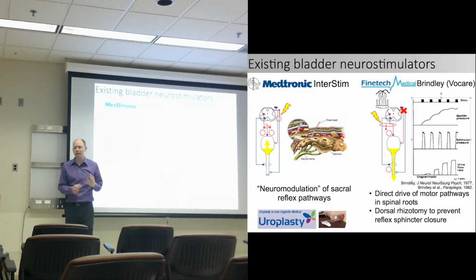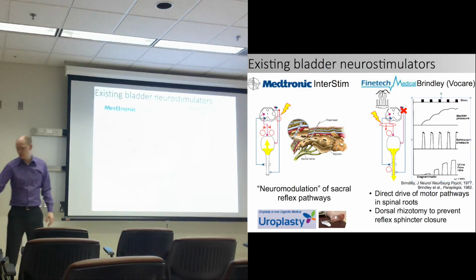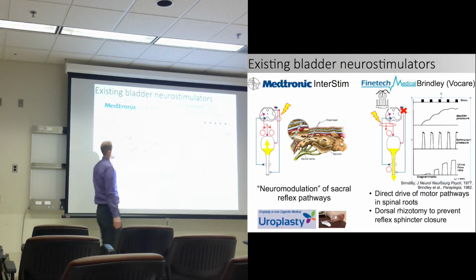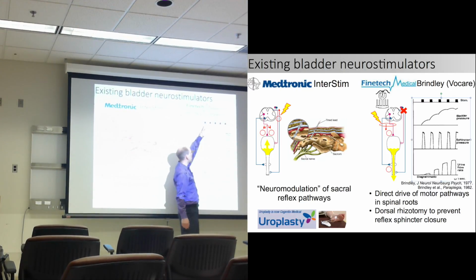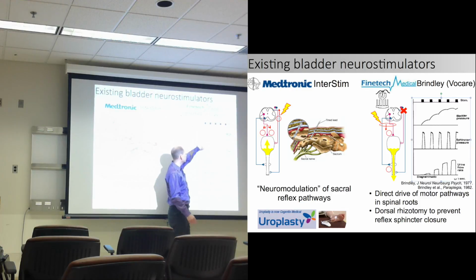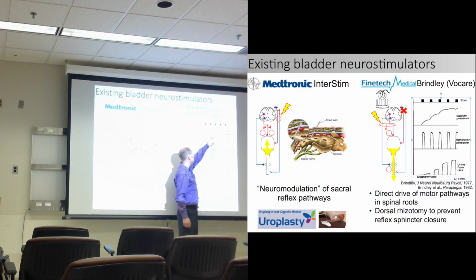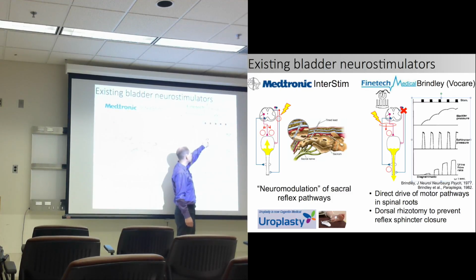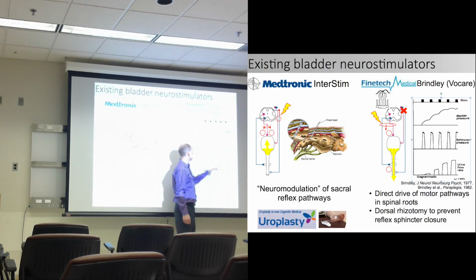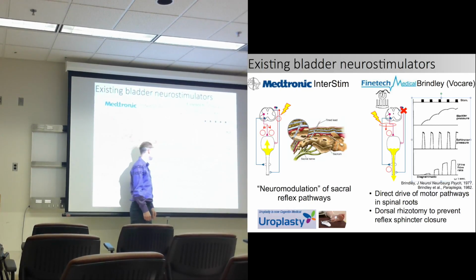So contracting the bladder and sphincter at the same time is not desirable. Fortunately, there are two different types of muscles. So an on-off stimulation paradigm is used. The sphincter, which is a somatic muscle, just like the muscles in our arm, contracts right with the stimulation. But the smooth muscle of the bladder has a much slower contraction time as well as relaxation time than the sphincter, so the sphincter relaxes during the off period. And so it can lead to urine release during those stimulation off periods.